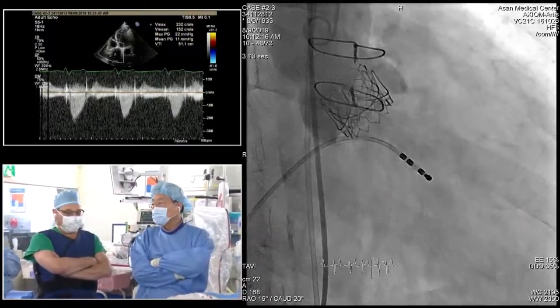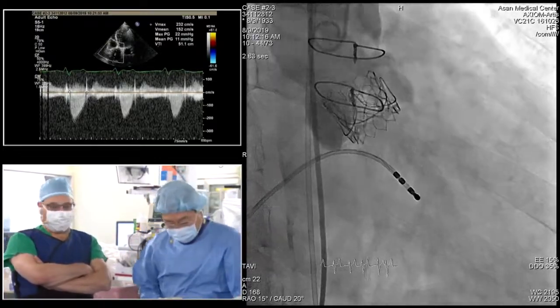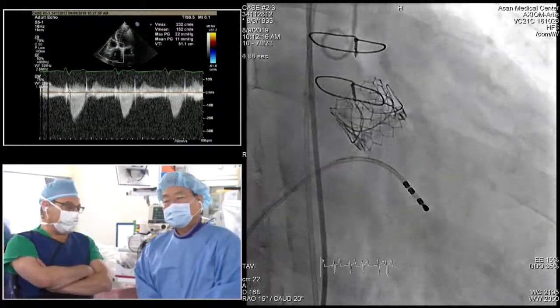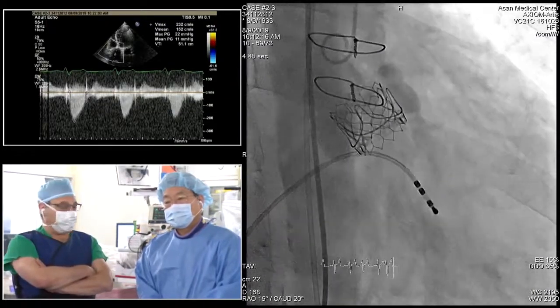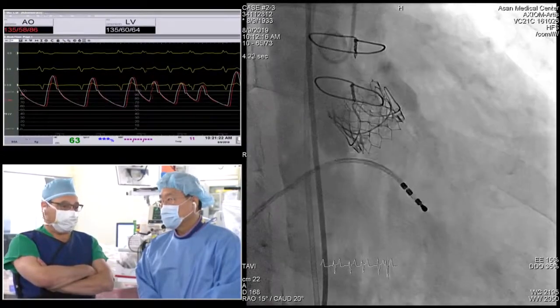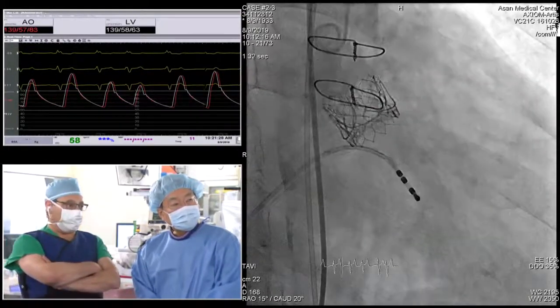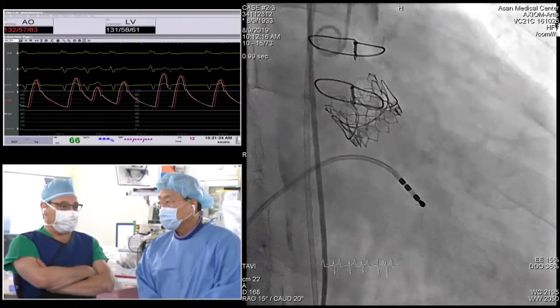I think Eberhard raises great points, which is, we don't know the long-term natural history of these fractured valves and whether dilating very aggressively damages the leaflets and they don't last as long. We have a lot of things we still need to learn about it. We know they work acutely. We know they're generally safe, but they're not perfectly safe. So when you don't know the long-term outcomes and it's not perfectly safe, it's important to make sure you know how to do it and that you need to do it. So I think Eberhard, you raise a lot of good points, and that's a lot of the reasons why we continue to do it that way.